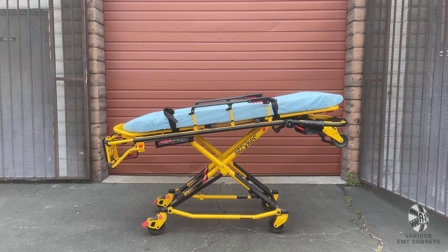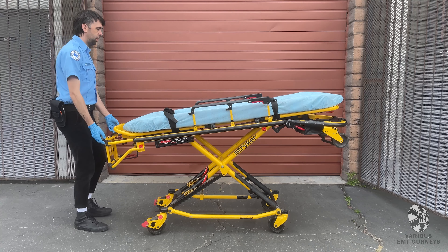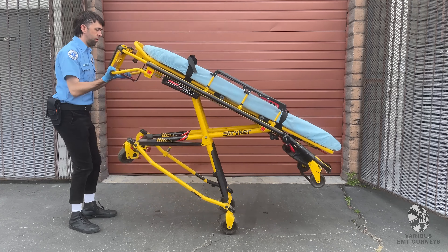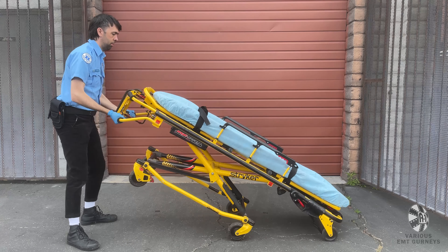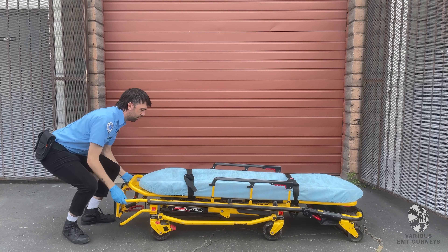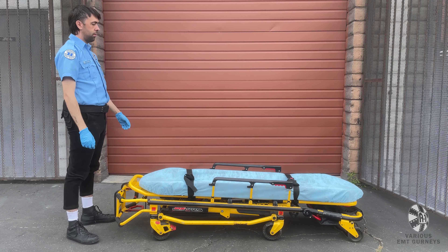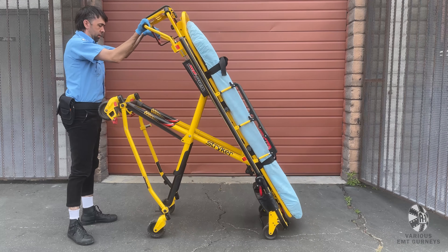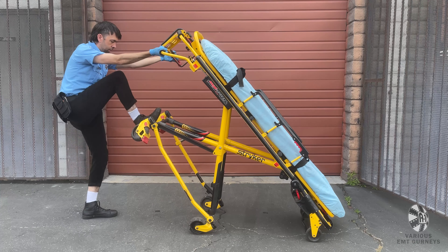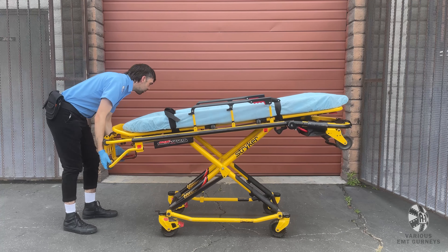If you wish to lower the Stryker by yourself, make sure that there is nothing resting on top of it. Grab the foot end of the frame, then tilt the entire gurney upwards. Pull the release lever and slowly drop the gurney until it's in the folded position. To raise the gurney by yourself, pull the release handle, then tilt the gurney up. Release the lever to lock the undercarriage, then tilt the gurney back into a flat position.